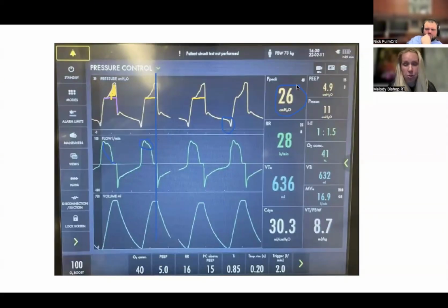So I would probably up my pressure control, try to settle them, and then see if, with supporting their work, they start to slow down. Then I can start to peel the onion on what this patient probably has going on, to figure out how to get them comfy.